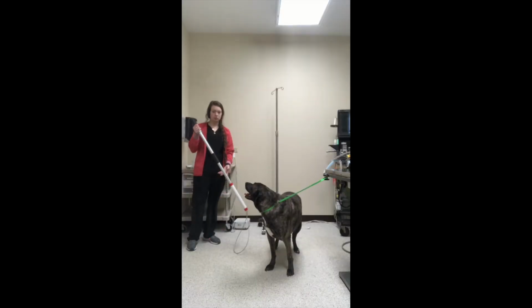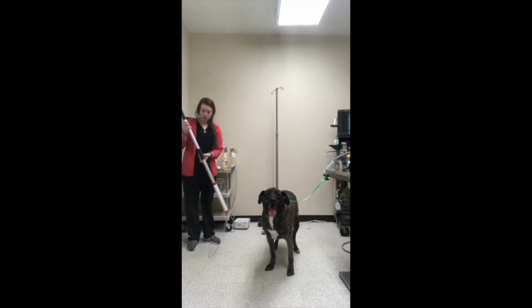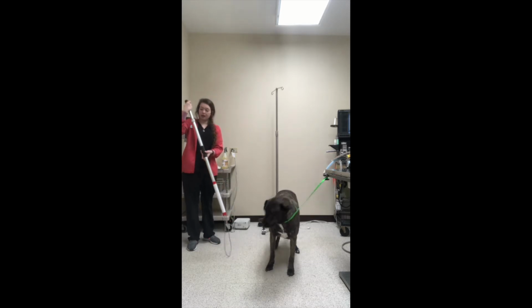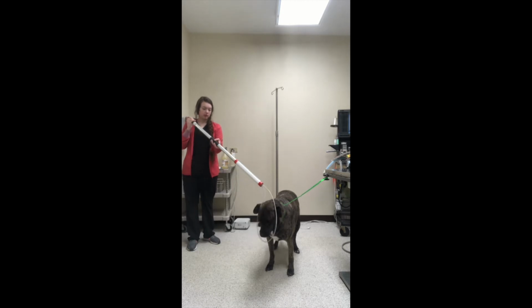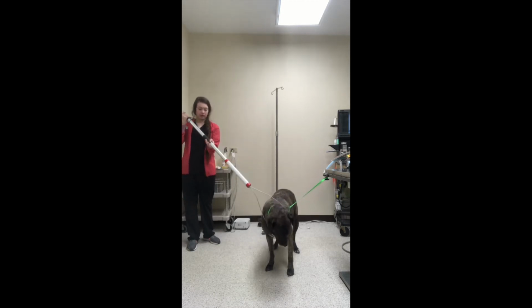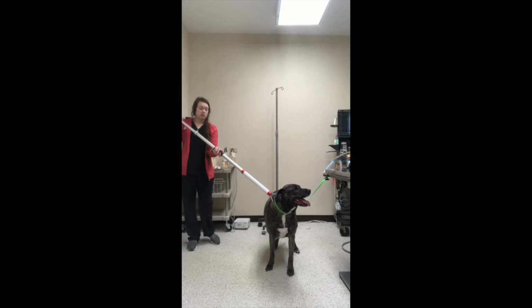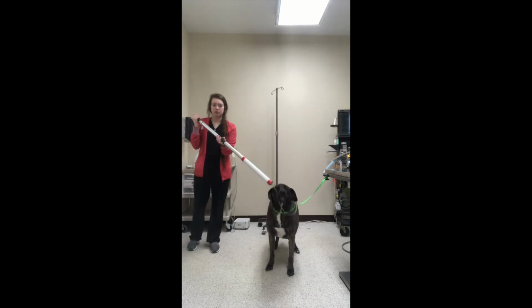Okay, so I'm going to demonstrate how to use a rabies pole. This is Sam. He is a really friendly dog, but just for the purpose of this video, I'm going to use him. So the rabies pole twists to tighten and release. So I have it loosened up all the way. So I'm going to slip it over his head and then pull back on the pole and then tighten it, twist it to tighten it. So you would use this on any rabies suspect or aggressive dogs to minimize any injury to the staff or the patient.